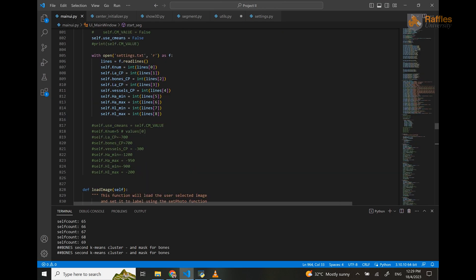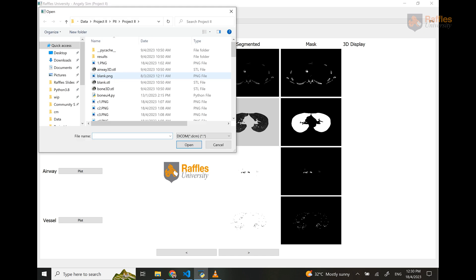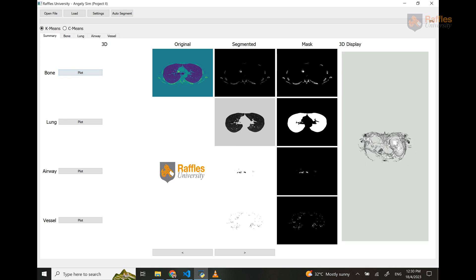This is how the user interface looks. First, we have Open File. When the user clicks on Open File, it's going to ask the user to load the medical image that they want to segment. It's going to automatically go through every slice of the medical image and automatically segment each part.